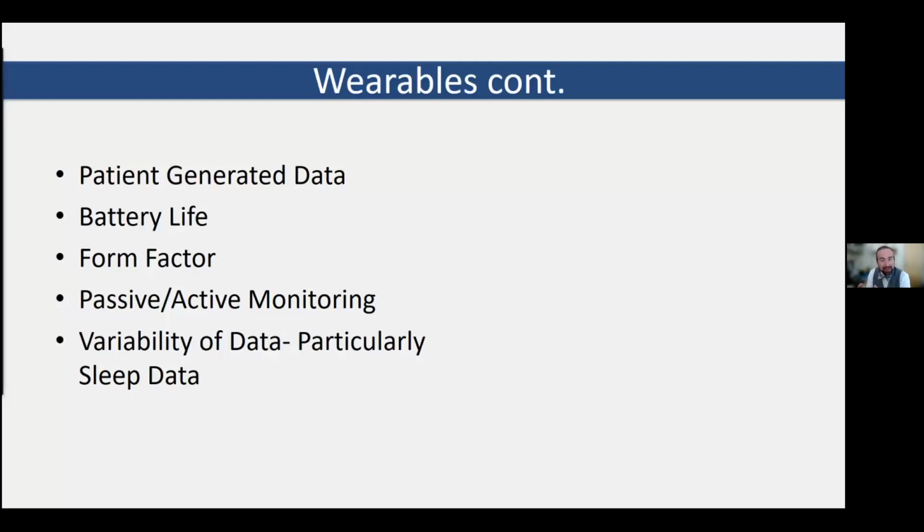In general, we expect these devices to become smaller, more powerful, less obtrusive, and more medically relevant. Additionally, we expect patients to want their telehealth healthcare teams to be more aware of the data collected by these devices.